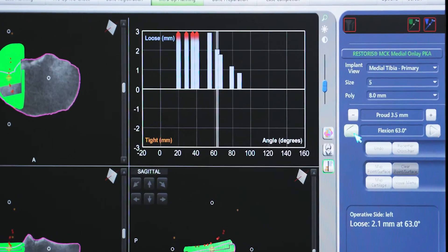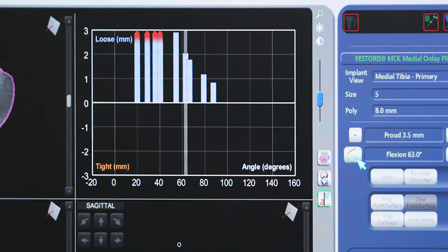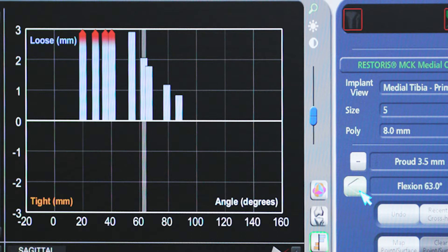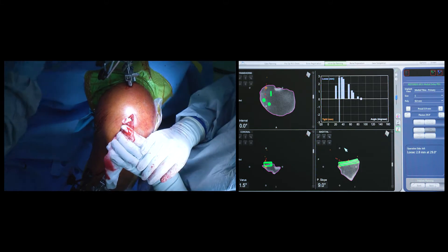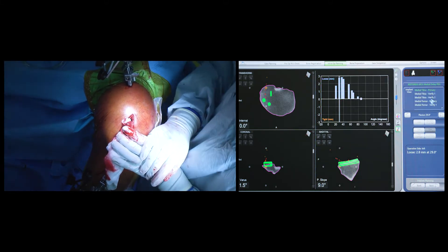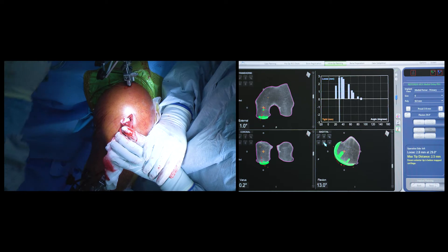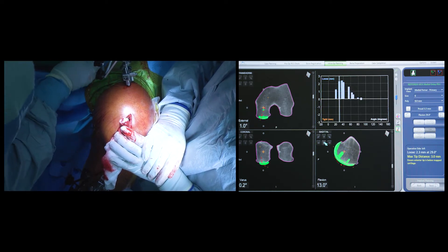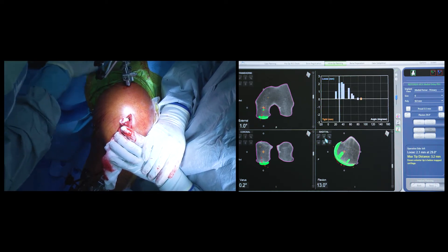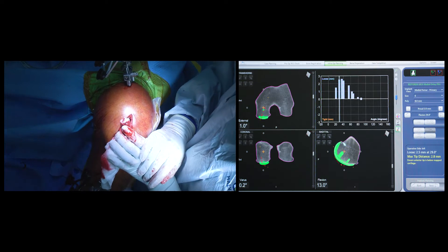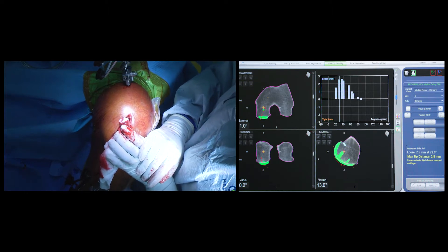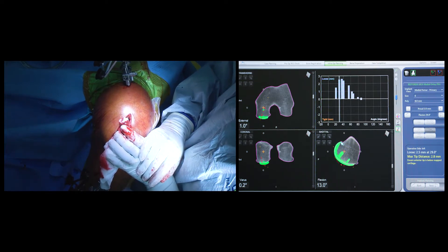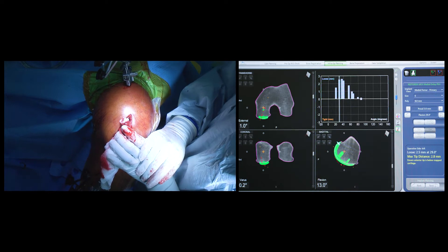As you can see on the top right-hand picture, at the moment, the extension gap is rather lax with medial joint opening of greater than 3 mm and it is a bit too tight in flexion with opening of 1 mm or less. Over the next few seconds, you will see me making adjustments and changing the rotation and orientation of the prostheses to ensure a consistent medial opening of around 1.5 to 2 mm throughout the range of motion.